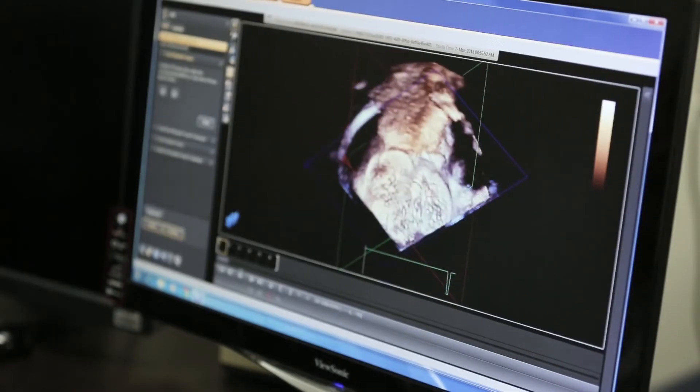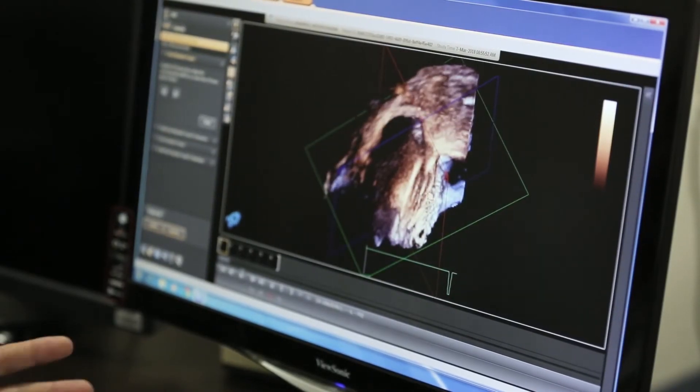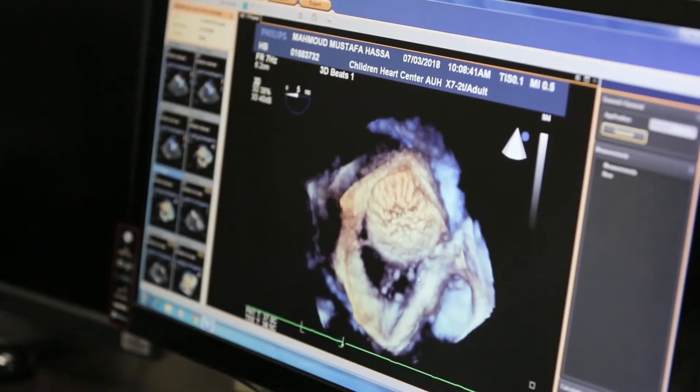We evaluated this defect and based on the evaluation, we put another device. Those are the three devices here. We can evaluate them and look at them from different perspectives to make sure they are stable. They're sandwiching the remnant of the septum — the wall of the heart's septum — from the inside.